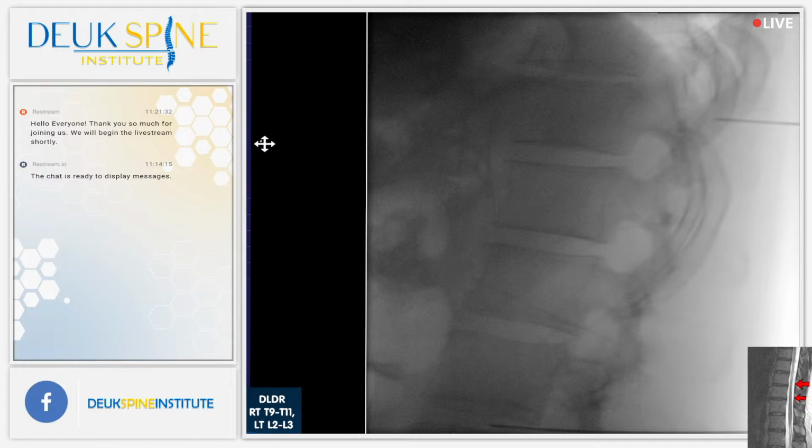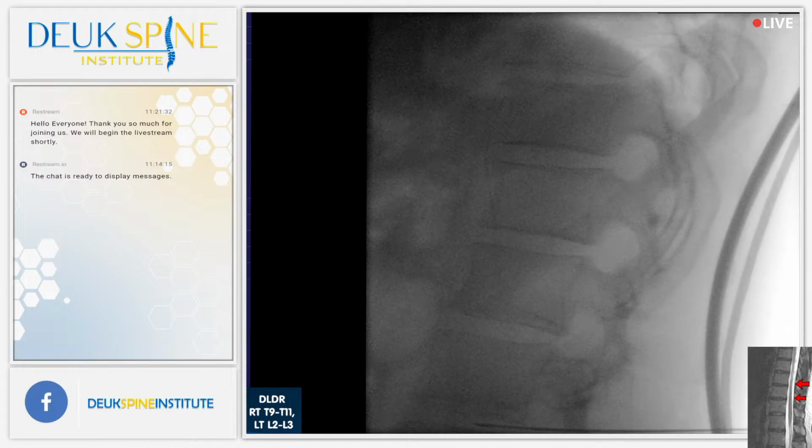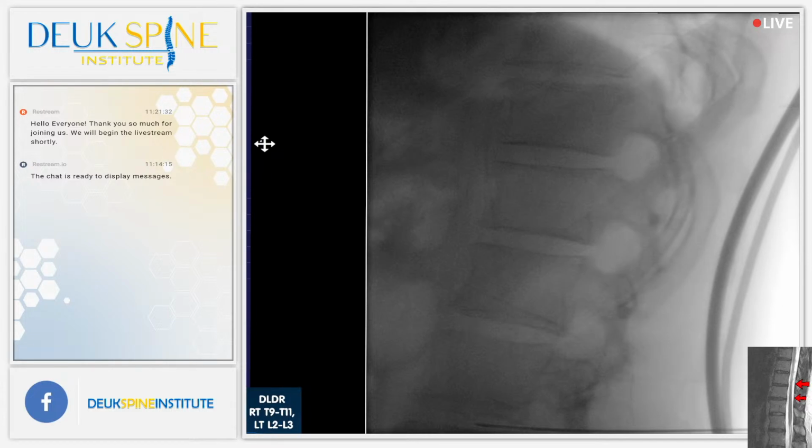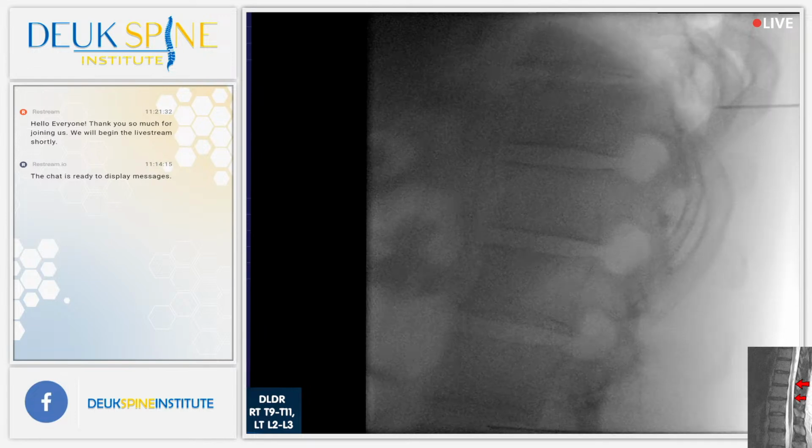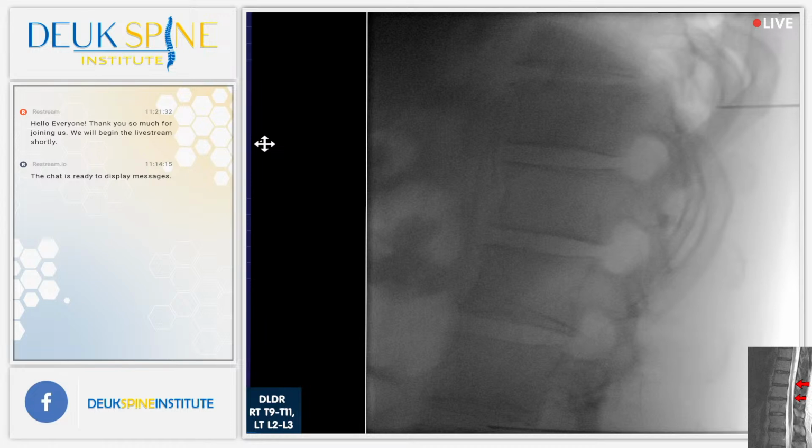All right, let's get some num-num. Num-num is numbing medicine. It really makes it more comfortable for the patient and the anesthesiologist, and ultimately the surgeon. Helps with the vital signs, right? If patients aren't in pain, their vital signs stay stable. Shot. All right, so at this point, lateral. We're pretty close to that disc. L2, L1, T12, T11, T10. Let's go ahead and move north just a little bit.